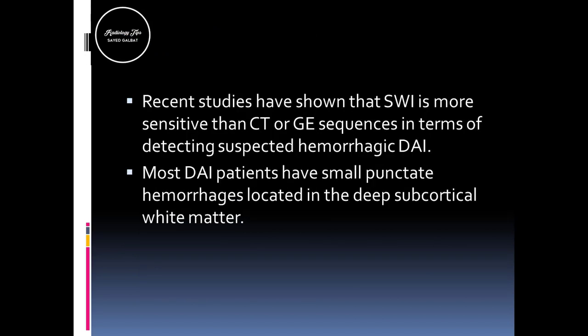Recent studies have shown that SWI is more sensitive than CT or gradient sequences in terms of detection of the suspected hemorrhage or hemorrhagic foci in traumatic brain injury.